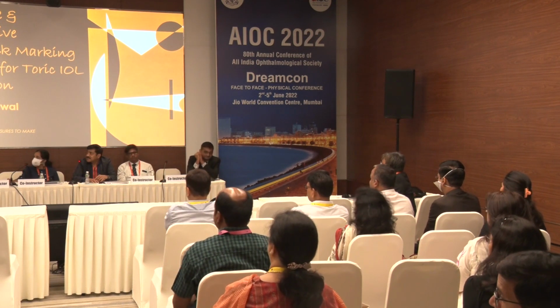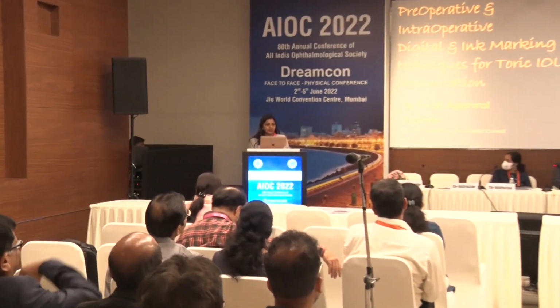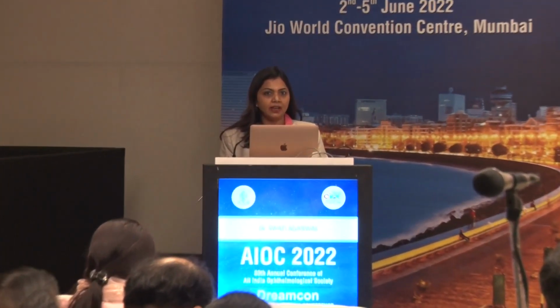Good afternoon, everybody. I'm Dr. Swati Agarwal, and I'm going to discuss today the preoperative and intraoperative digital and ink marking techniques for toric IOL implantation. For any toric IOL to give results with accuracy and precision, the reference markings should be spot on. The reference markings could be slit lamp assisted, bubble marking, freehand, digital marking, femtolaser assisted, or straightaway intraoperative aberrometry.